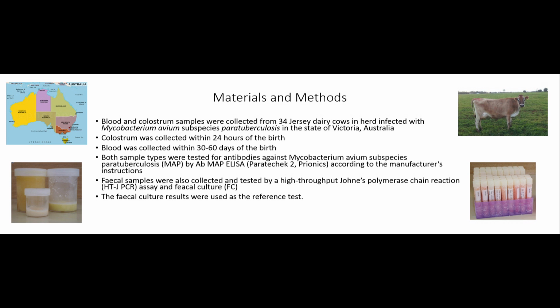We also took fecal samples, and we ran those with the HT-J PCR, and we also did fecal cultures, the gold standard or reference standard for Johne's.